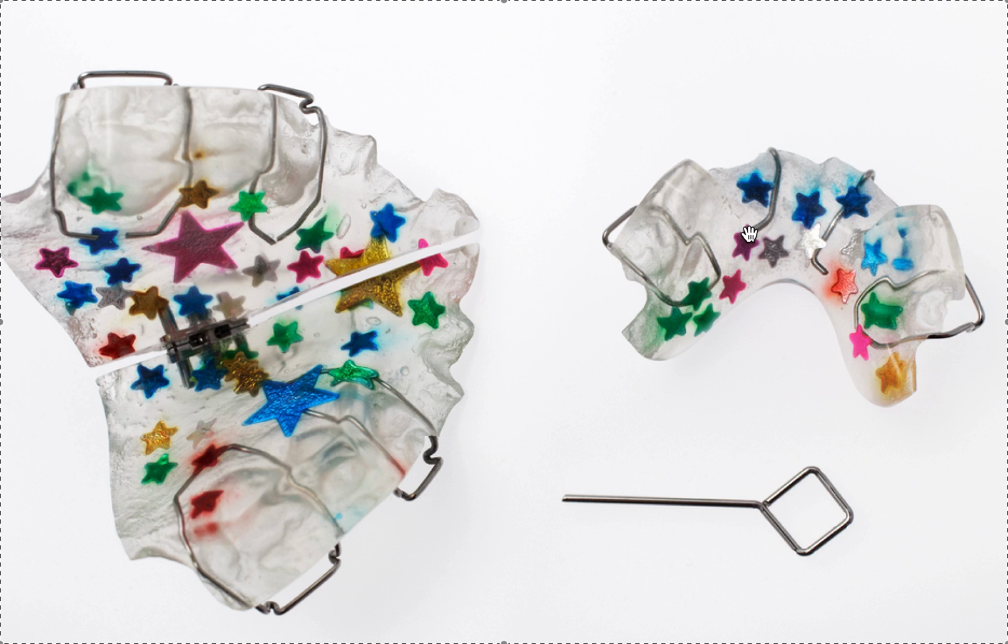I have kids. So eat with them in, come home, mom takes them out, brushes them. Kid brushes teeth, put them back in. So twice a day, mom brushes them, eat with them in, works way better. And you'll get better outcomes if you do that. So that's pretty much it.